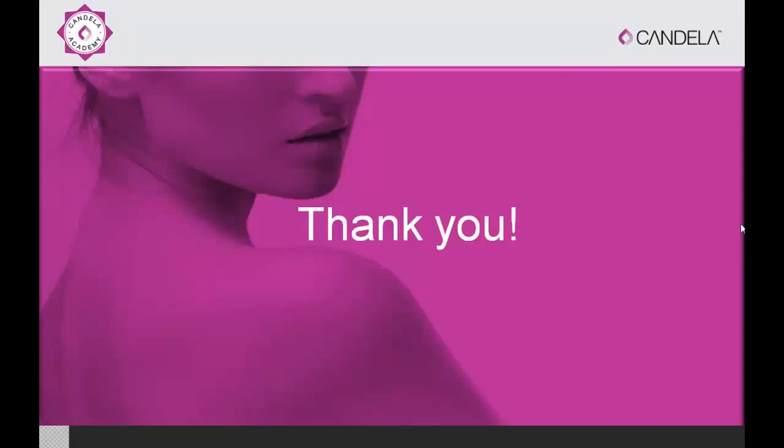Does it matter if you use zoom first, followed by resolve? No, I don't think so. There are colleagues who would use the zoom handpiece first, followed by the resolve handpiece. I like to start with the resolve handpiece and then do the zoom, and that's what we did when we were going to publish our series, and with many of the cases that I have shown you. I don't think it's particularly a problem if you start with the zoom first, unless you're treating epidermal pigmentation.